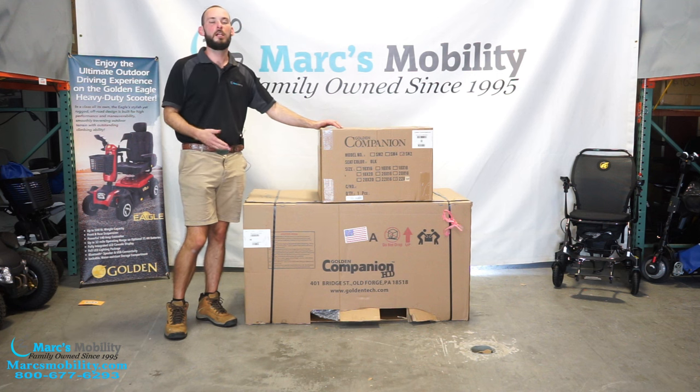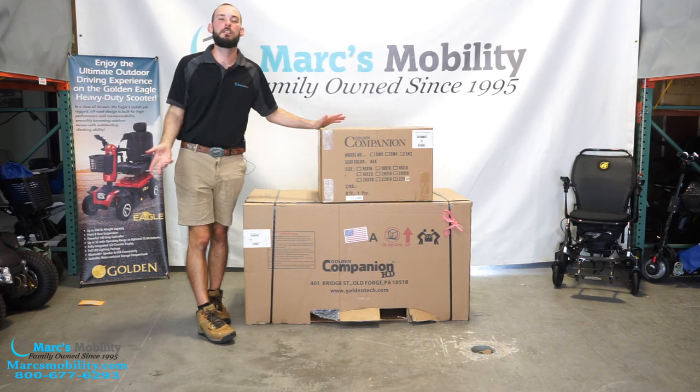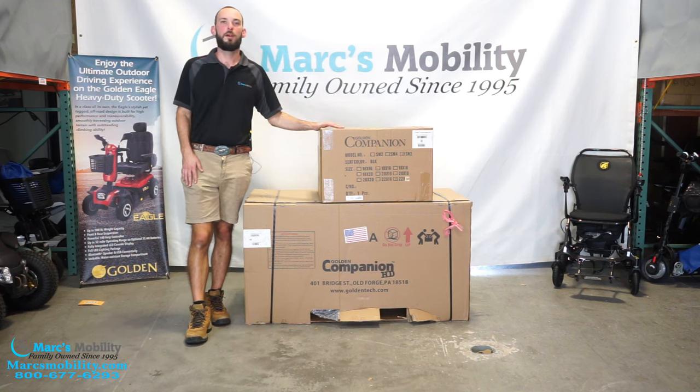There might be a third box, which would be your basket. I'm not sure if this unit has a basket included or not. The other GC models do have a basket shipped separately, but we'll find out.